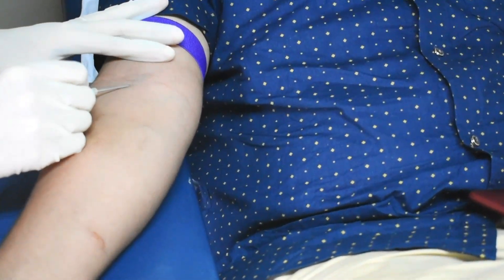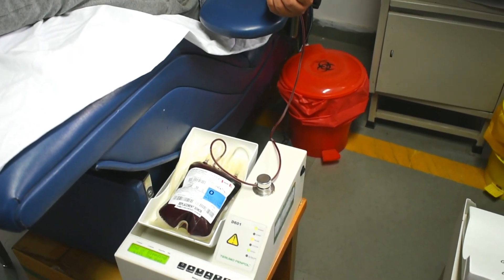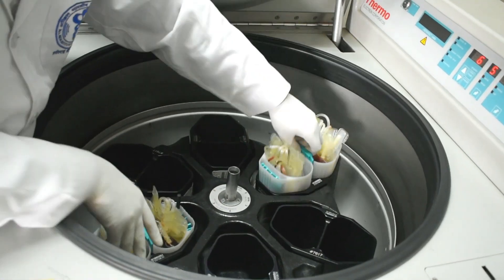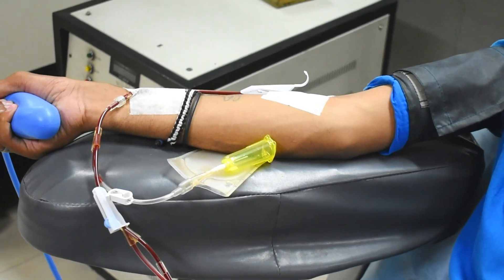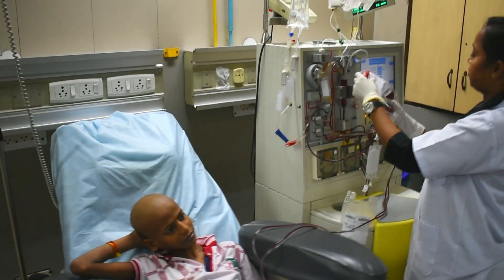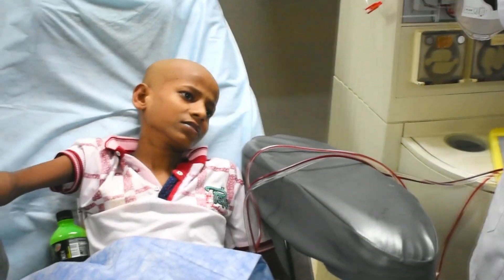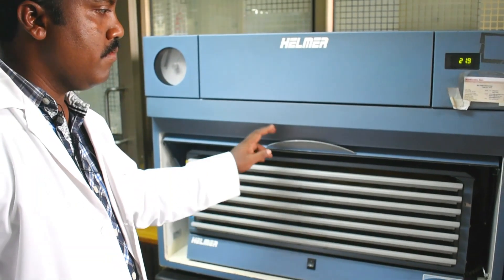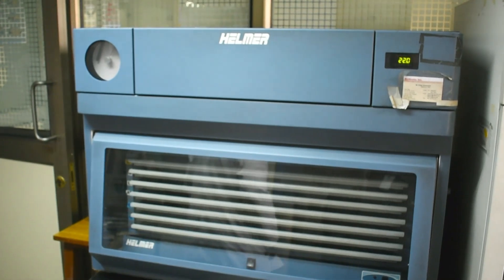Blood banking involves screening of donors, blood collection, component preparation, and blood testing. Sophisticated techniques performed by laboratory technologists allow automated blood grouping, cross-matching, and separation of blood into various components, which can be stored and used more effectively according to the needs of the patient. The challenge is to integrate the production of high-quality cellular and non-cellular blood components with the development of need-based research and clinical involvement.